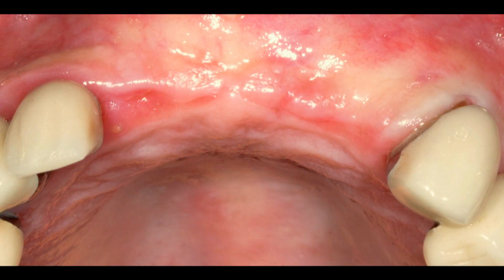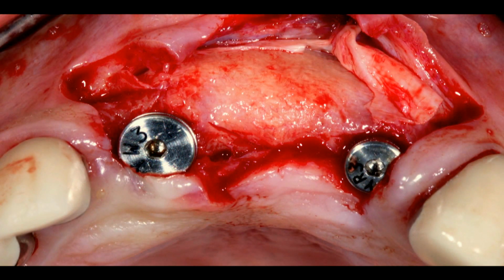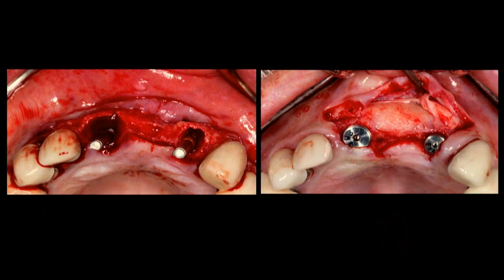And we can see the healing at about 4.5 to 5 months. Open this case up. I did have immediate implants in there that were buried. So you have some remnants of the collagen membrane, but very predictable regeneration in this type of a defect. But I think using the growth factors that are inherent to that BioXclude membrane definitely helps. And I think you can see through all of our cases that the bone turnover is very, very good.